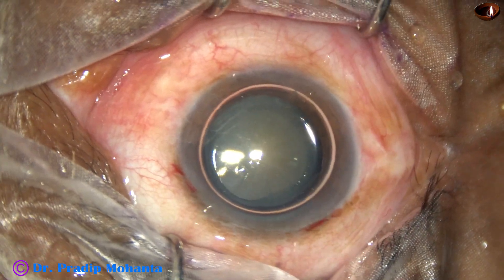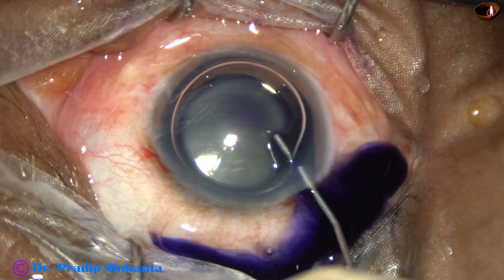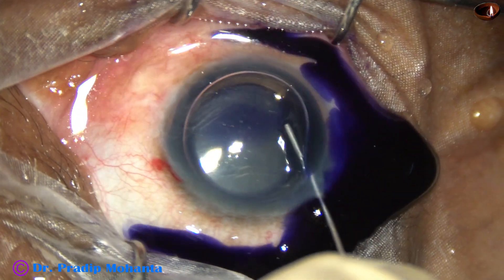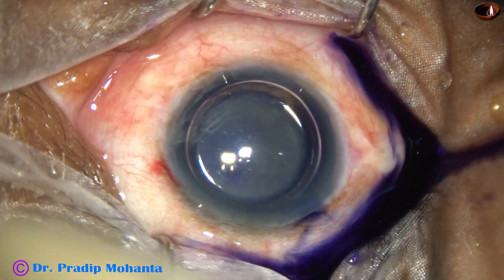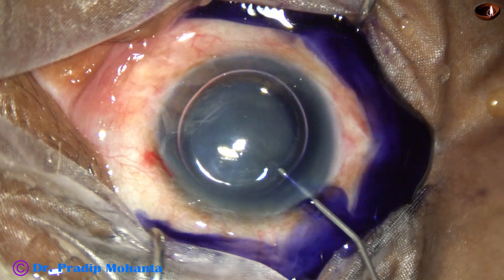In white cataracts, to get more contrast, Trypan blue dye is applied over the anterior capsule underneath an air bubble. The air bubble helps in quick staining of the anterior capsule.